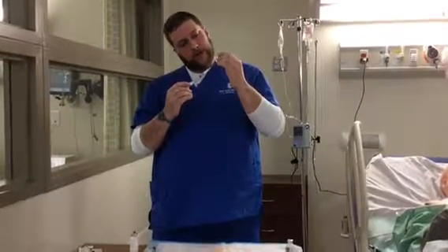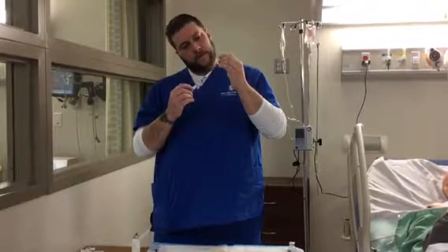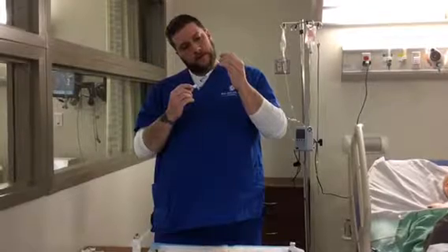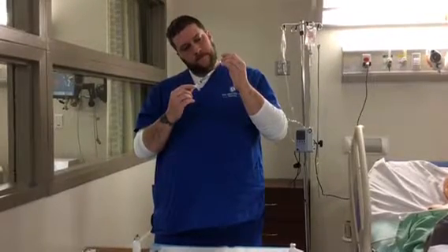And be careful to keep the needle in the vial the whole time, as to not break the seal and get all the medication.